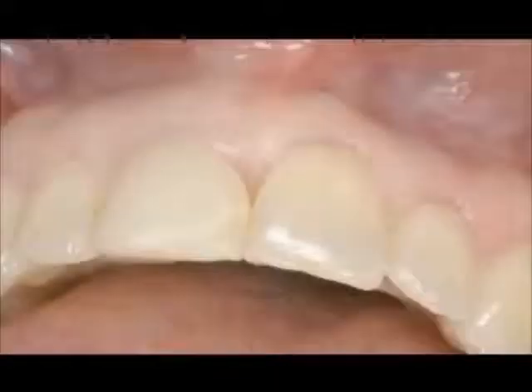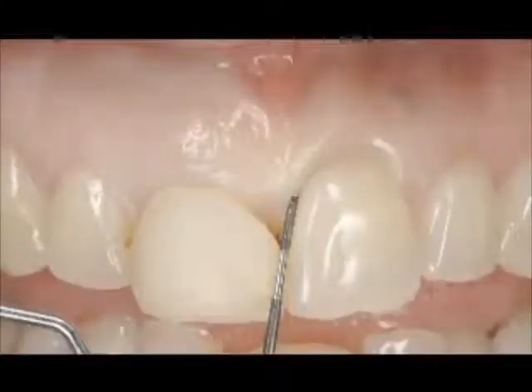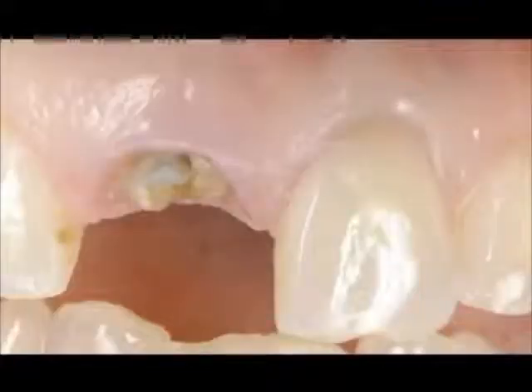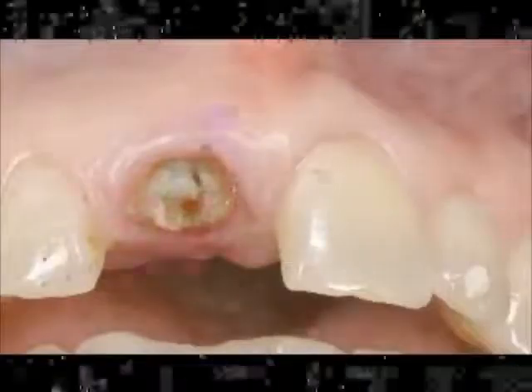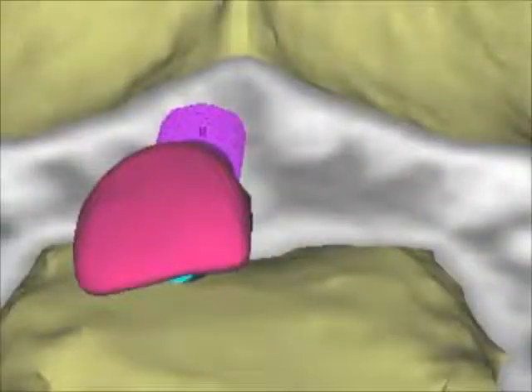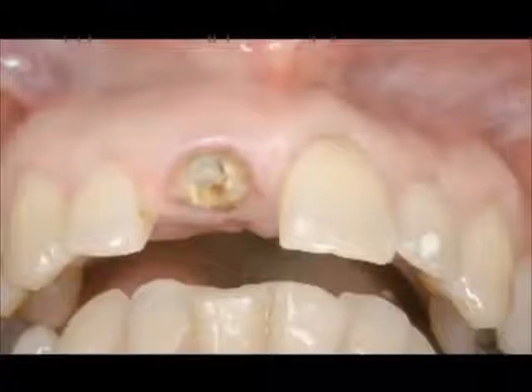We take a look at the health of the tissue, the thickness of the ridge, the vertical interproximal height of bone on the adjacent natural teeth, and this superimposes the 3D section onto this for planning. We know that we can place the implant so that it is placed towards the palatal.